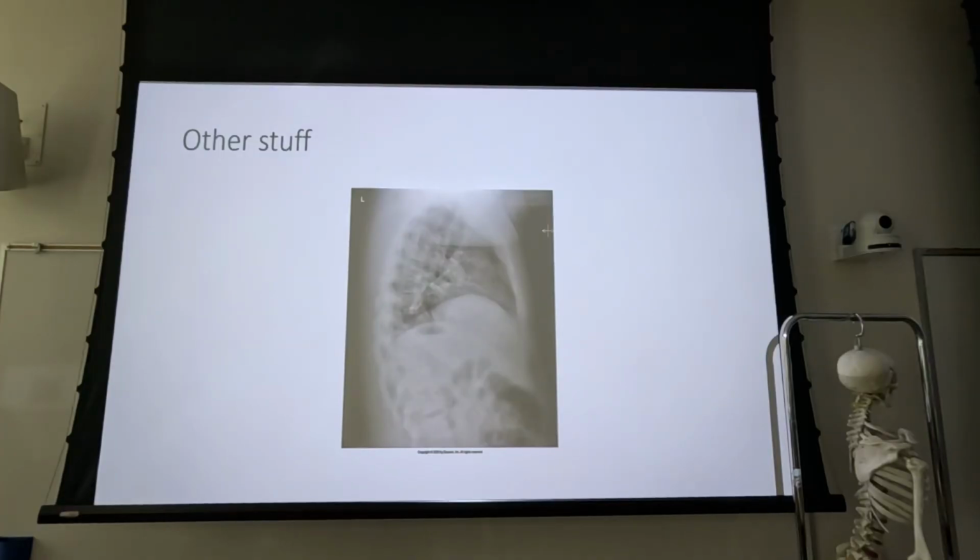Collimation. Yeah, we got half a lateral L-spine, but really the collimation is not quite as bad as it looks. Lack of inspiration. There's almost no inspiratory effort here. The arms are straight up in front of the patient, so we've got that soft tissue there. We've got a lot going on. Oddly enough, the most common positioning error is not all that bad. We don't really have any rotation here, but everything else isn't good.